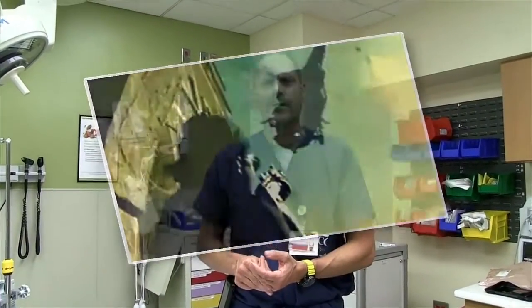In the movie Black Hawk Down, wasn't there a fatality? Yeah, that's really the exact injury that this is meant to control. It really doesn't necessarily fix anything, but what it does is it allows you a bloodless field to be able to get better control, either in the operating room or even in the field, to get better wound packing or to ligate vessels potentially.